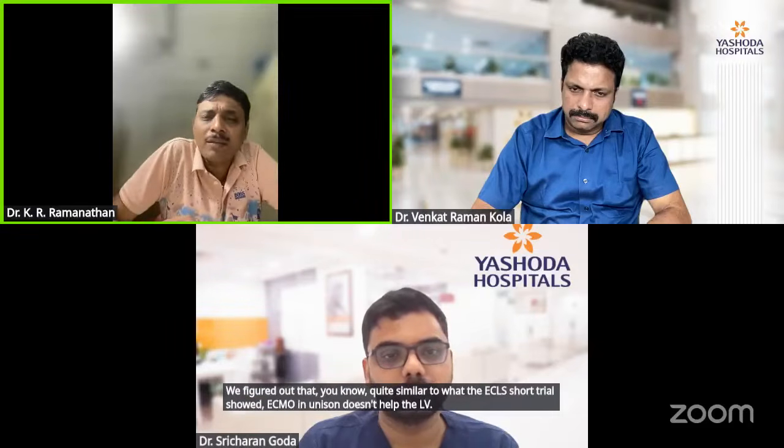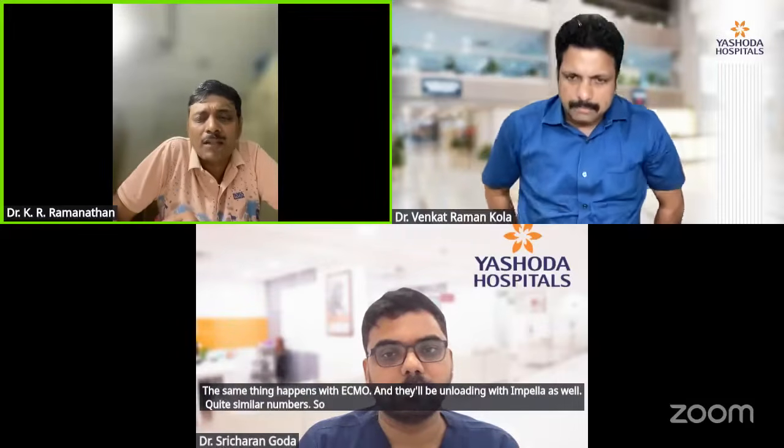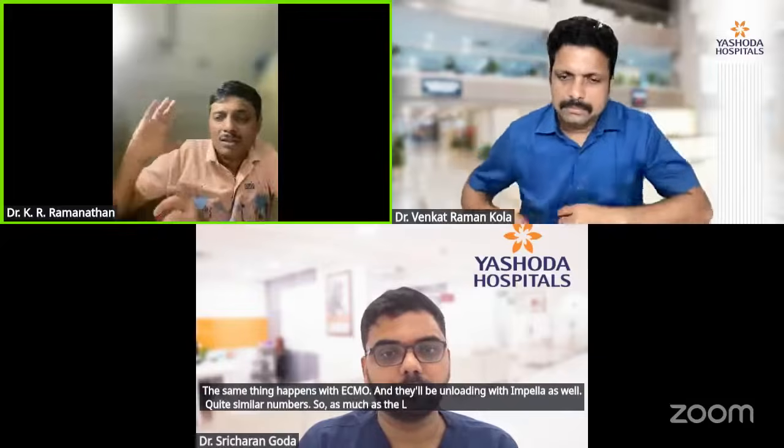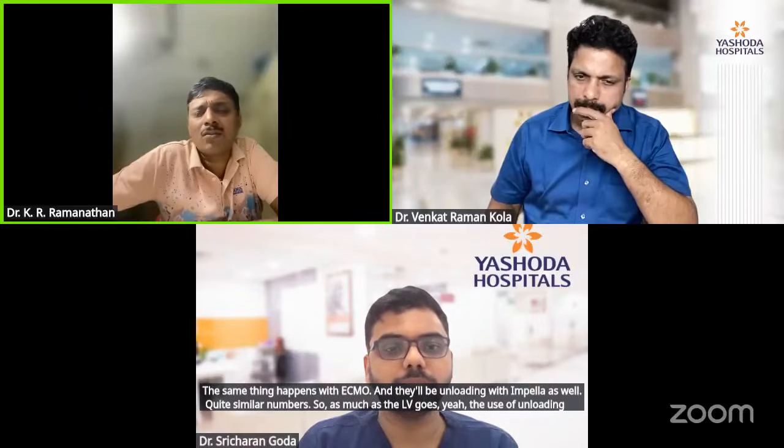But if you use ECMO with IABP, it definitely helps. The number needed to treat is about 8. The same thing happens with ECMO and LV unloading with Impella as well, with quite similar numbers. So as far as the LV goes, the use of unloading strategies has to be thought about even when the patient goes on VA ECMO.